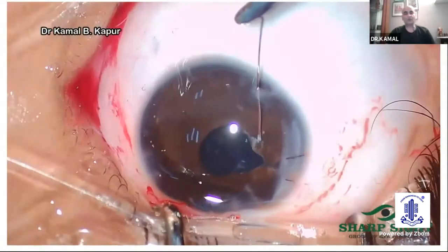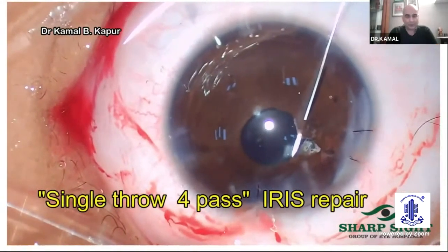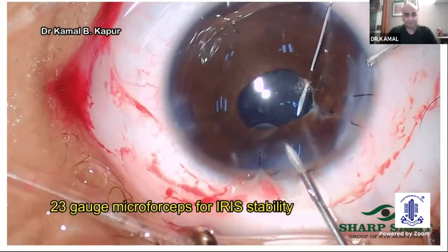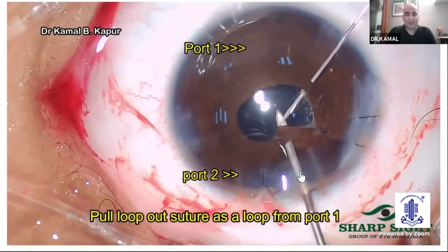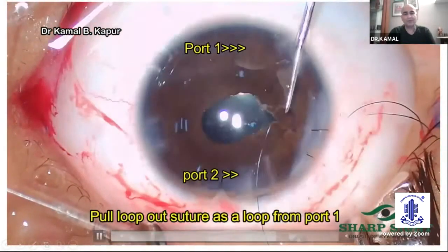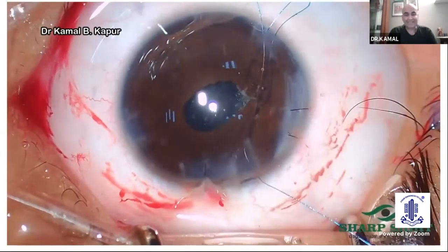Now I go to do the single pass 4-throw technique as described by Dr. Amar Agarwal. I think this is a beautiful technique. It has transformed the way we handle iris. So we go ahead, we do the railroad technique. Now I've started making only 1 port. Earlier I was making 2 ports. I had a discussion with Dr. Amar. I use 1 port from where I go with the needle, and the other port I just use to railroad. Now you do a 4-pass technique.